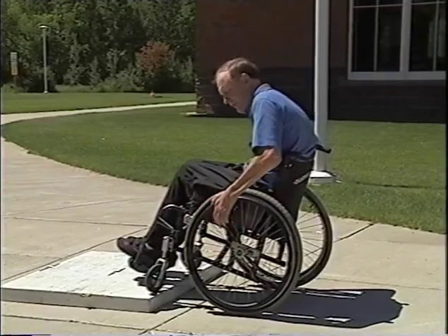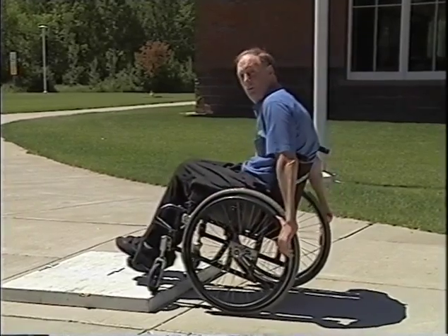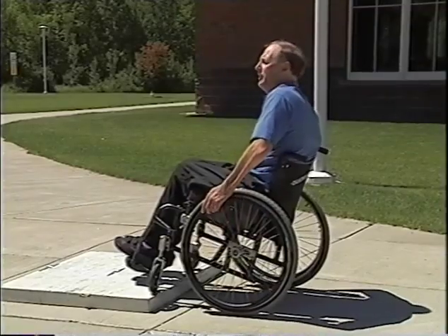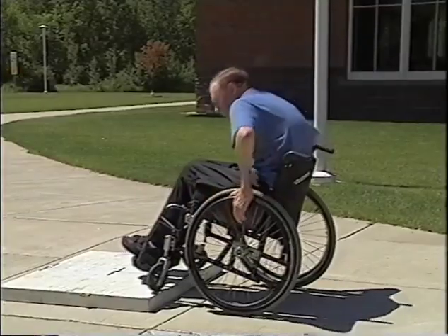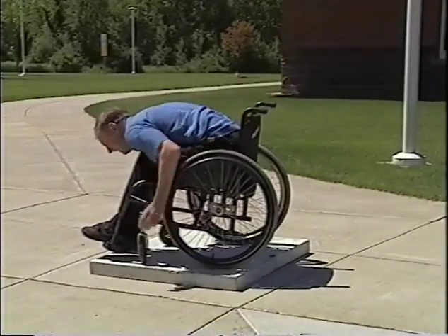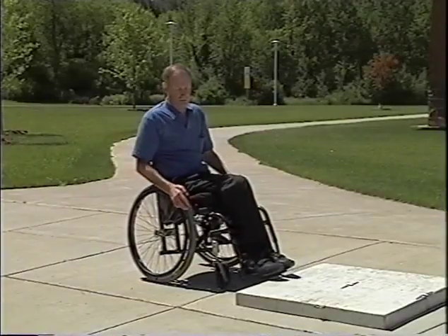So your hands are in front of the axles. Don't be back here because you'll be pulling the chair up when you go to pull. So pushing down, make your body go down first, and then when it stops moving, you push. So just, all right, and pushing forward, and we're up.